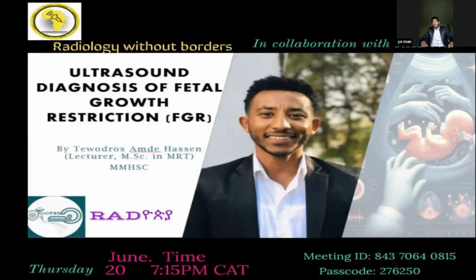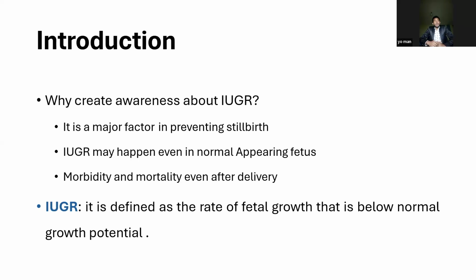Okay. Thank you so much. Today, we're going to see one of the most controversial topics in the realm of ultrasound diagnosis, and that is fetal growth restriction. What is the importance of this webinar, or the importance of creating awareness about IUGR for radiologists and medical radiologic technologists?